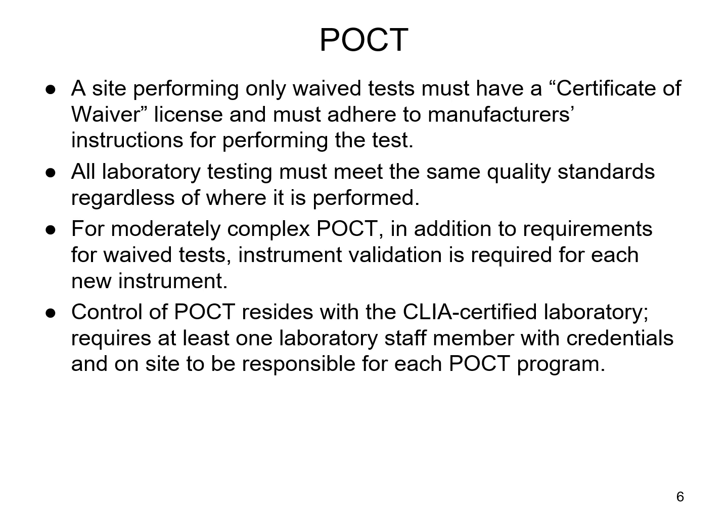Ultimately, CLIA does set the regulations for what you have to do and the requirements that you have to meet for your particular laboratory setting, based off of the type of certificate you have. So if you have just a certificate of waiver, they do state what kind of personnel you must have on staff. Now, with any of these, you must always have at least a laboratory director, and that's usually the doctor that's going to oversee that laboratory or that office.